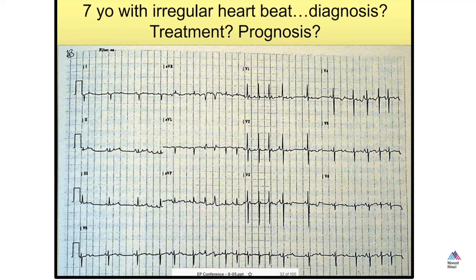But is this atrial fibrillation? Now you have the tracing in front of you. So do you think this is AFib? I don't think so. I can see P waves in most of the QRS complexes. Yes, I agree. I don't think this is atrial fibrillation either, right? Because just as you say, there are clearly some beats at the beginning of this tracing and towards the last third that look normal.